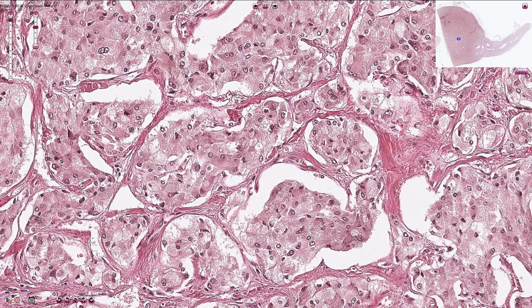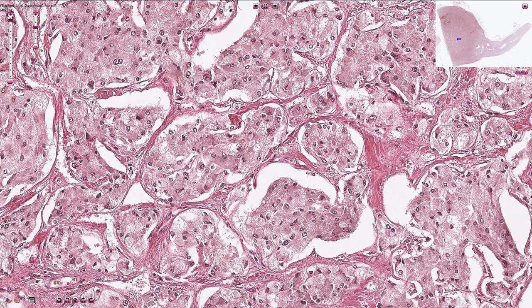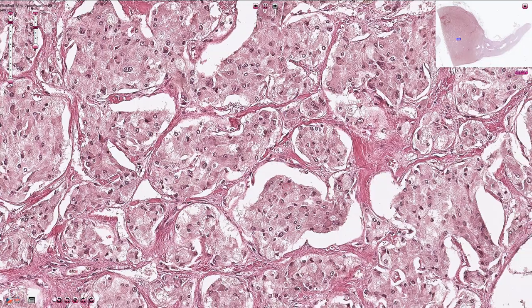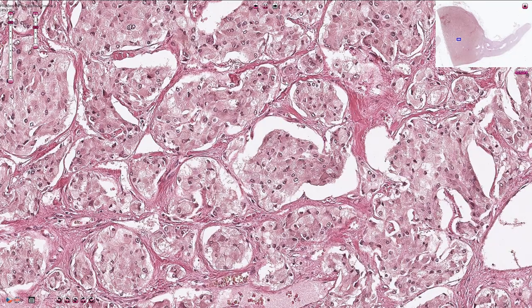Some pheochromocytomas can consist of solid sheets, or you can also see trabecular structures. Sometimes the cells are spindled or atypical, but typically classical pheochromocytomas are associated with these cellular nests. There are thin fibrovascular structures which encircle the cellular nests, and there are a lot of capillaries.